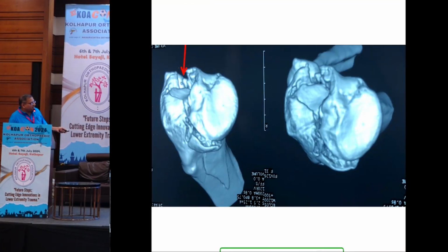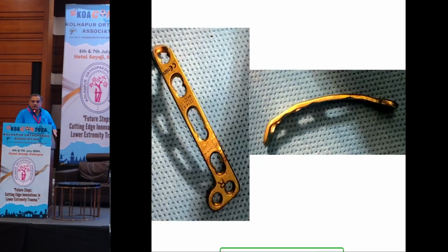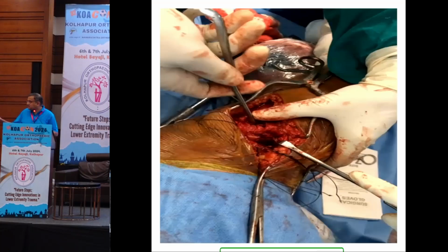So you can visualize that when there is a major posterolateral depression, this approach is extremely useful. After elevating it through the anterior window, because through the anterior window you elevate it, this is a subchondral screw which has been passed after elevation. A small plate, like a rim plate or a hugging plate. Now this is actually a video, because it beautifully shows. At the end you will run it, so that was the video of the first patient.